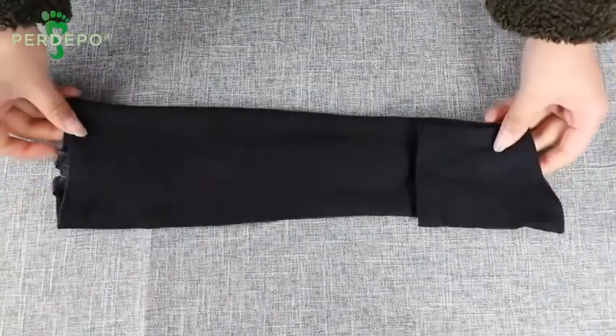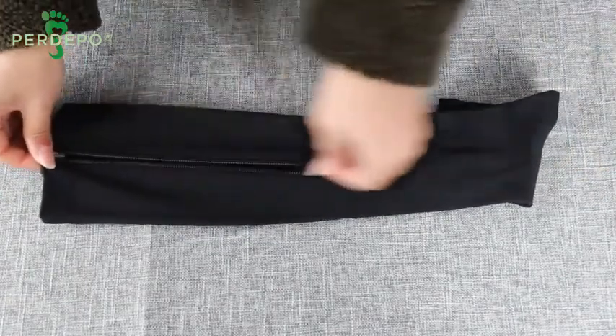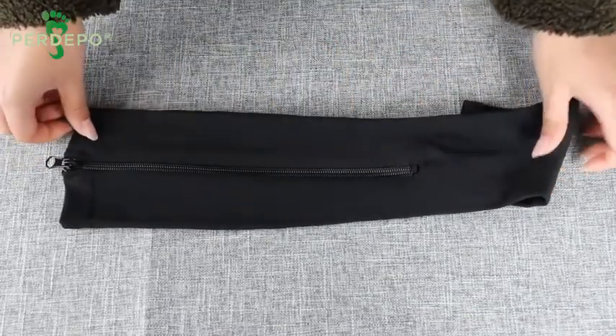And what makes them so special is that they are so easy to put on. You simply unzip them, put them on your foot, and then zip them up. Let me show you.